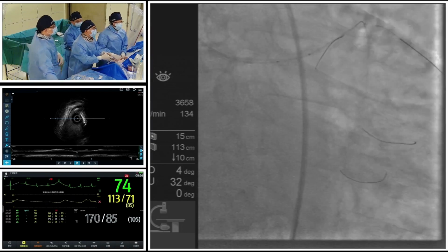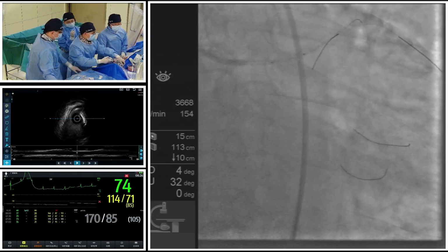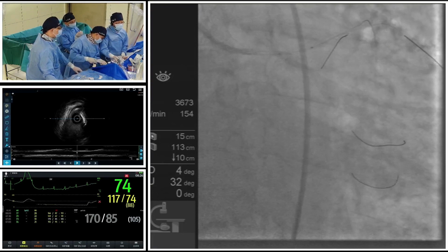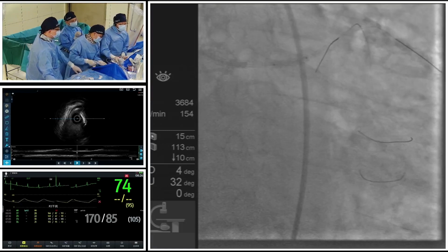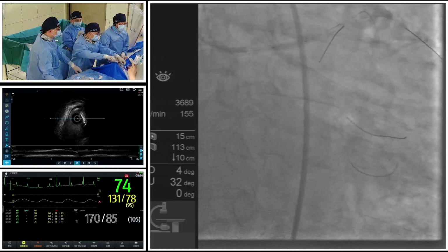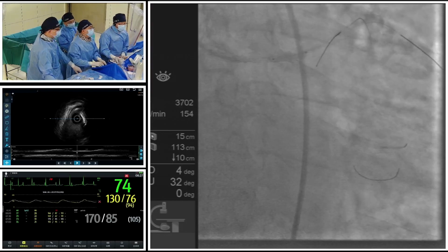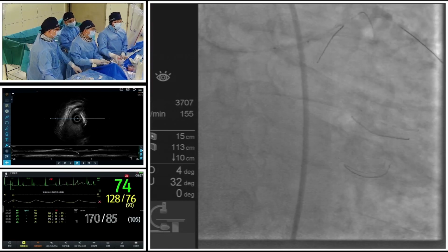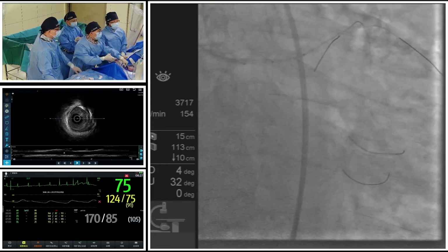And the second one is, like in this case, relatively large vessels. We know that if the vessel diameter is over 3.5 millimeter, the rotablation system, without the benefit of the wire bias, is less likely to perform debulking for relatively big vessels. However, in this case, we can see we can use lithotripsy for left main bifurcations, so it's suitable for relatively large vessels.